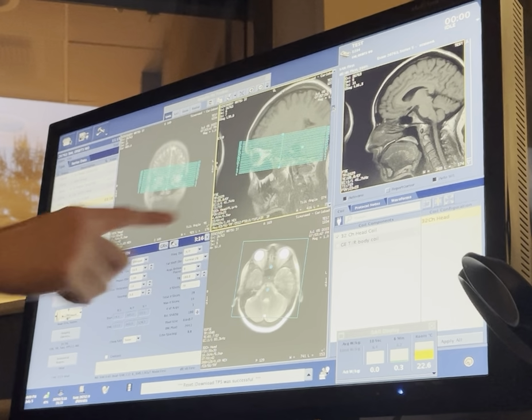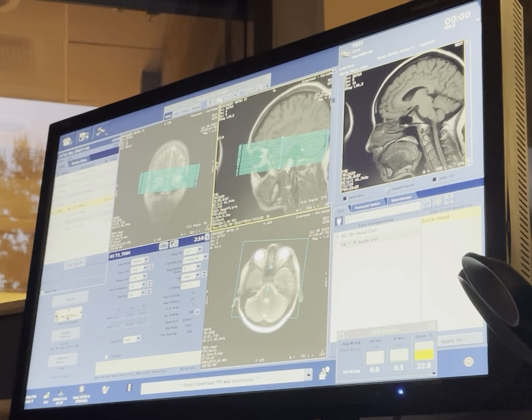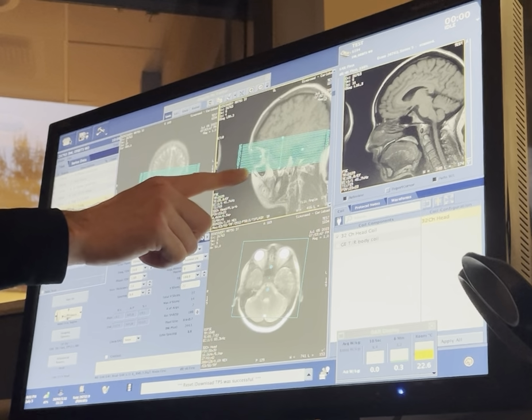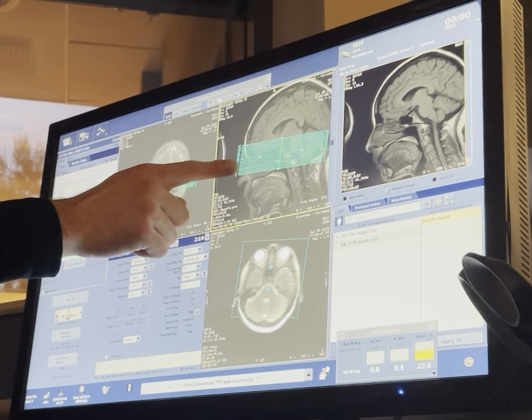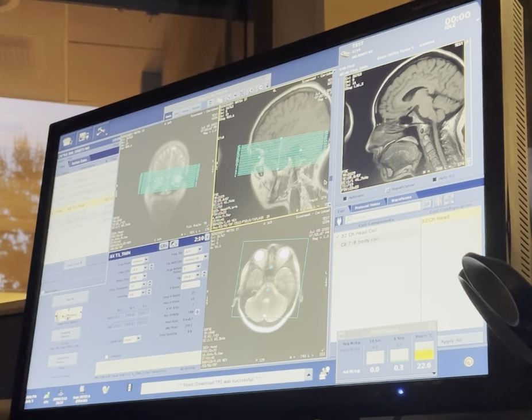Looks good. So I would cut like 2 slices from the top because you only want like 1 or 2 above the orbits, and then I would add like 1 below. Add one. Yeah. Now scroll through both eyes, all the way up and all the way down, making sure we're not cutting off the orbits at all. So yeah, go down. We look good right there. Okay, keep going. And right here. We look good. Okay, awesome job.